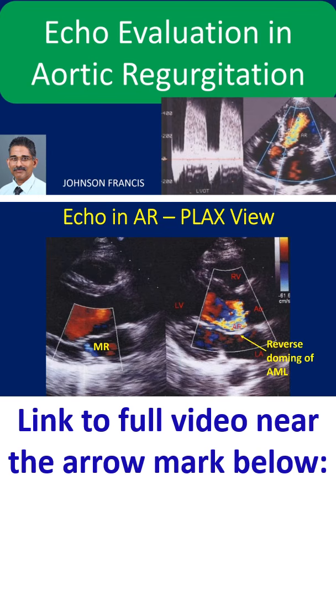Systolic frame also shows a trivial mitral regurgitation into the left atrium just behind the mitral valve as a bluish mosaic jet.